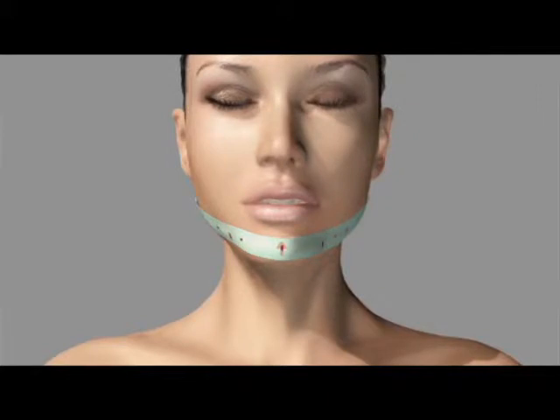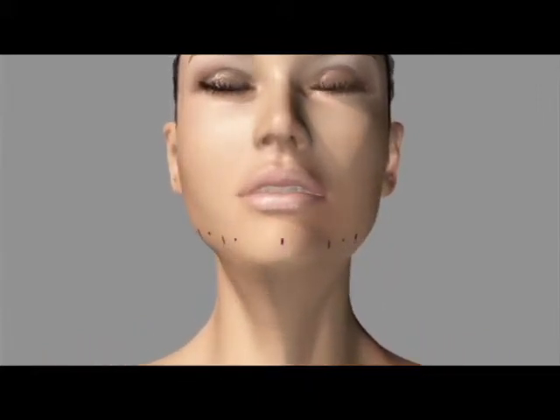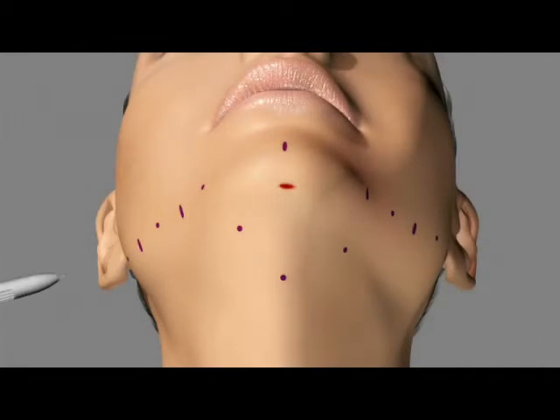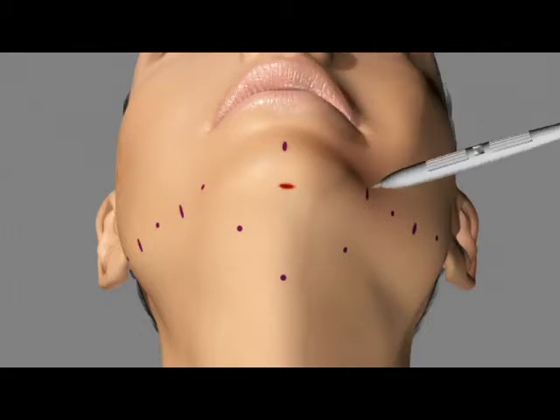Usually in a woman with a normal sized mandible, 3 pivot points are used on each side. In a male with a larger jaw, 4 to 5 on each side. The marks underneath the jawline indicate pivot points where the rod is able to pivot as it travels underneath the jawline over the curved surface. These random dots allow the rod to pivot as it passes underneath the jawline. The puncture device is then used to make a puncture in each of the marked sites. It is rotated to the left and right 1/2 turn, thus dilating the puncture.